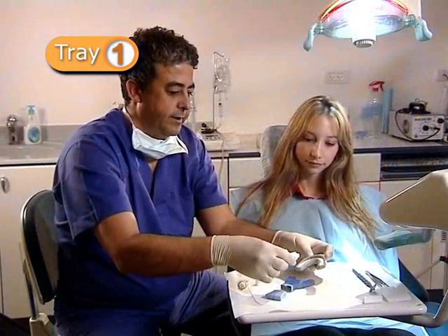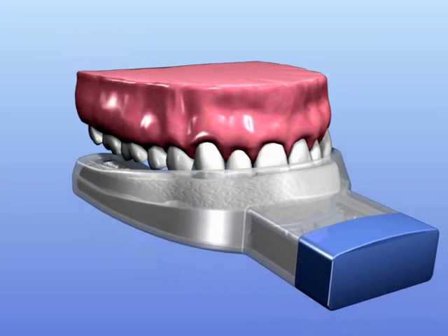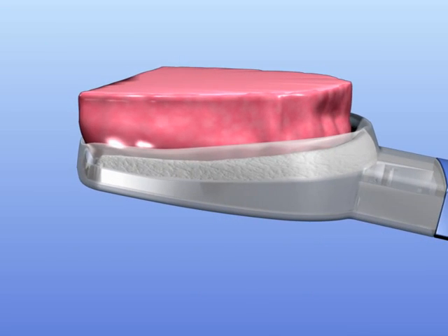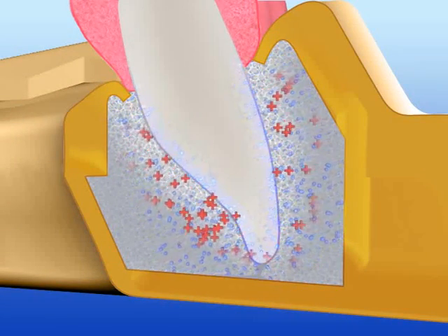In the first stage, a solution is applied into the absorbing sponge, and the teeth are essentially immersed in it for one minute. The solution assists in keeping the positive polarity of the teeth throughout the entire procedure.